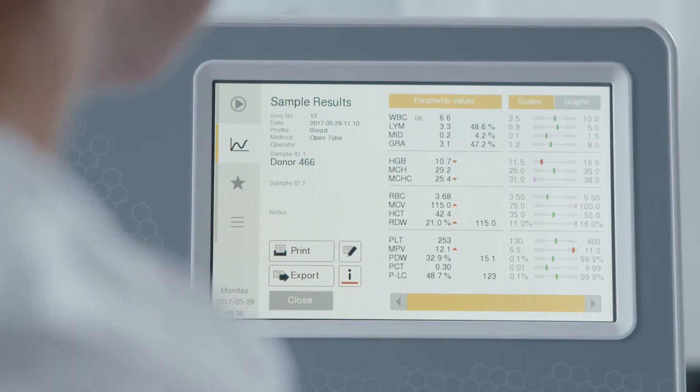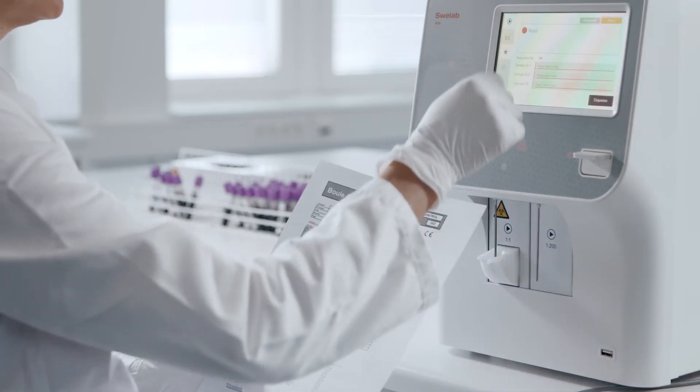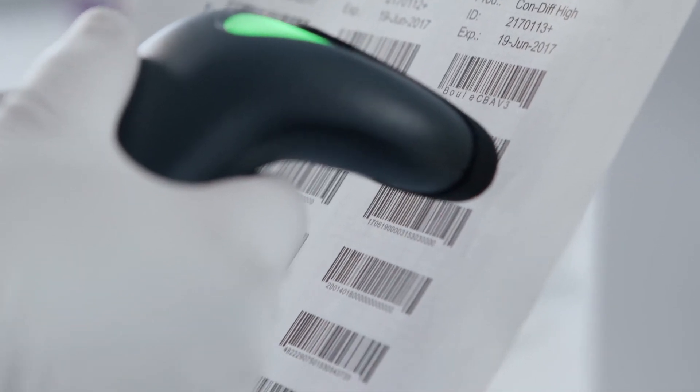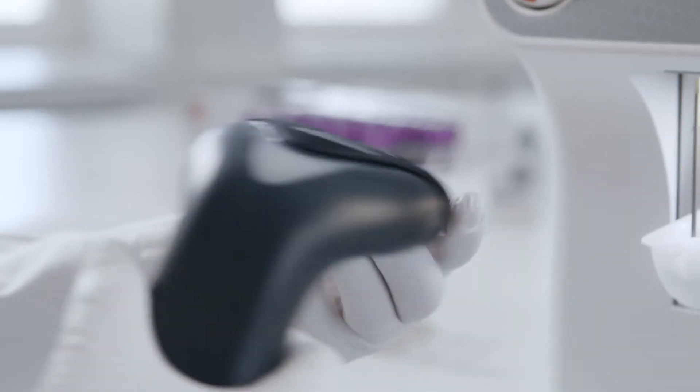A complete quality control program comes with every Swelab Alfa Plus analyzer. Loading QC information is easy — the touchscreen and barcode scanner enable secure, fast data transfer. Entering information takes just a minute, after which QC data is on hand whenever you need it.